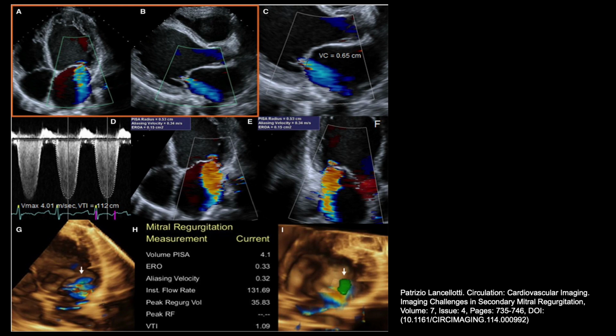The vena contracta width in the parasternal long axis view is another measure of the severity, with a cutoff of greater than or equal to 0.4 centimeters indicative of severe mitral regurgitation. Calculation of the ERA using the surface area of the proximal flow convergence is another approach to quantify mitral regurgitation.